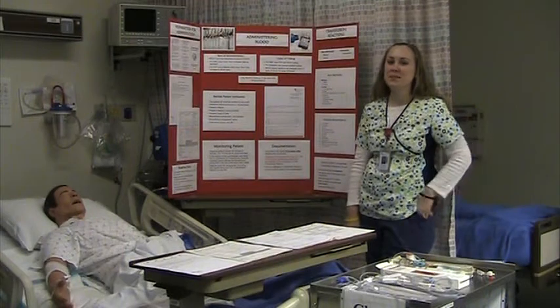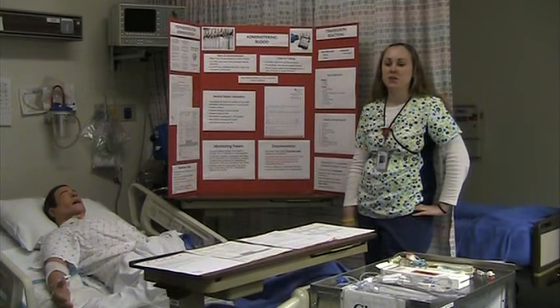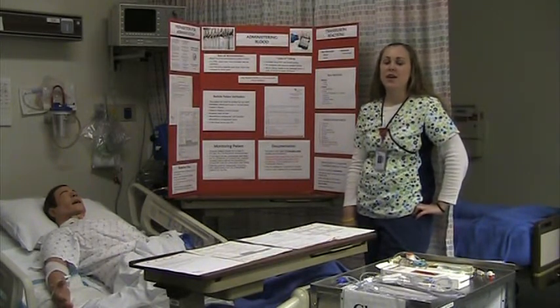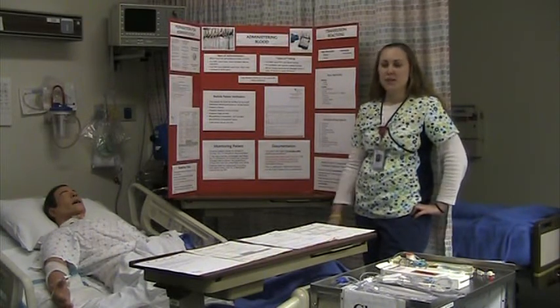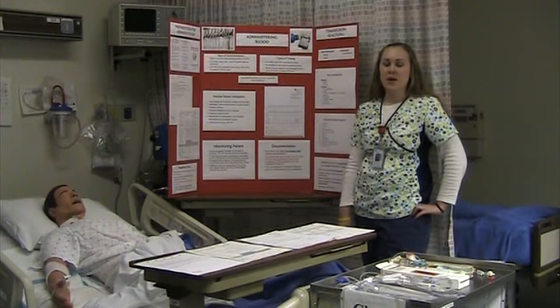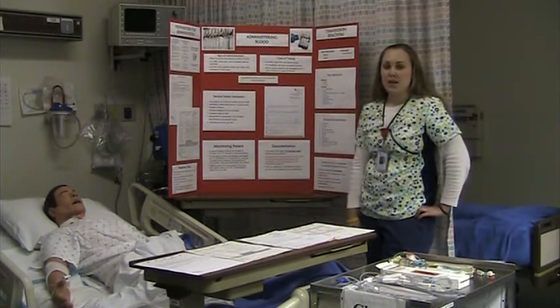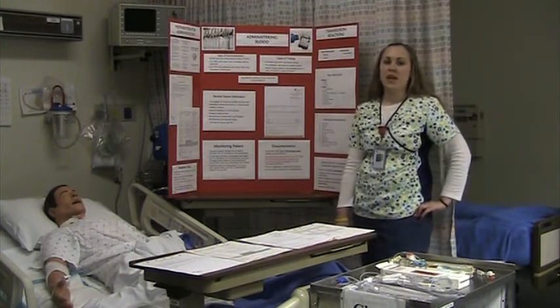Good afternoon, my name is Michelle Brown, and today we are going to be showing how to do blood administration here at Skills Day for all the Med-Surg, ER and surgical nurses here at Valley Care. I'm going to walk you through the process of how our policy and procedure states to administer blood and other blood products. The first thing that you do is you obtain an order.